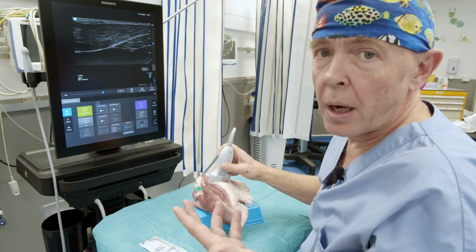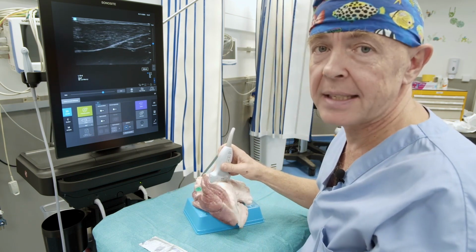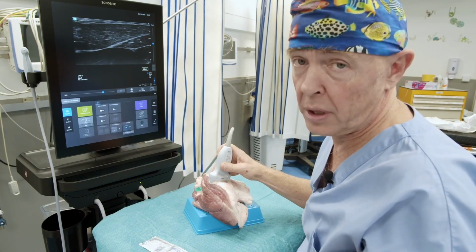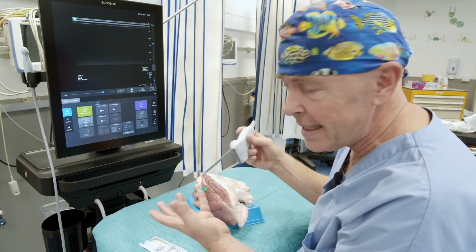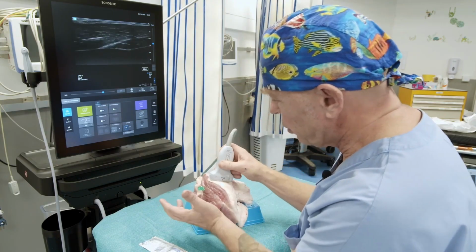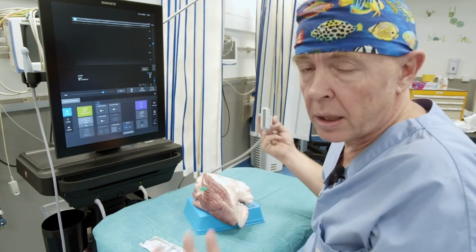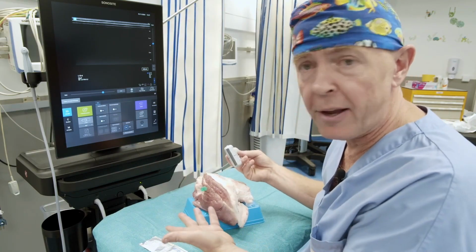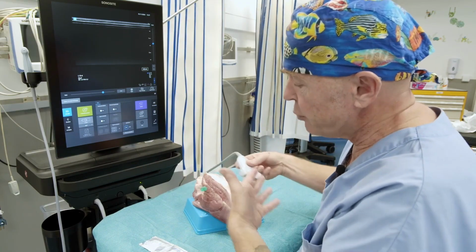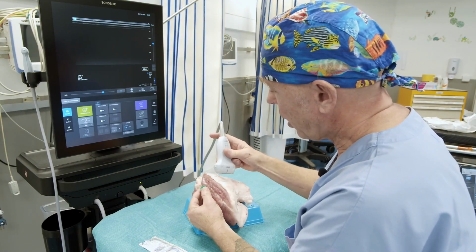The second exercise that you must learn to master thoroughly before beginning on the patients themselves, all right? So here we are going to leave the needle. As I was mentioning to you initially, we are quite tense, we apply tension, we are focused and all that, and we lose the needle. So take a deep breath and relax a little bit. You can effortlessly leave the needle in its position, just as I have done. There, it is a simulation exercise, yet it is remarkably close to real-life scenarios.